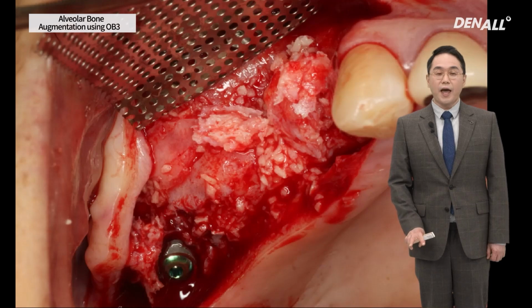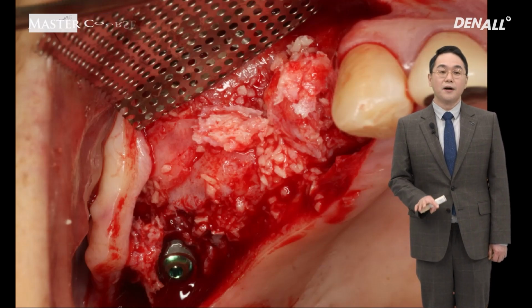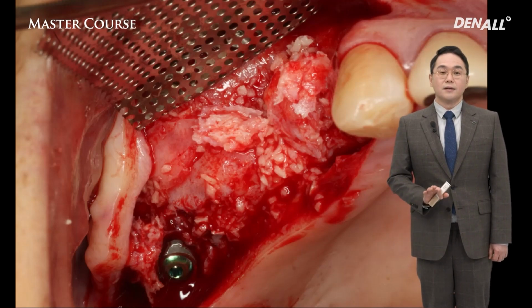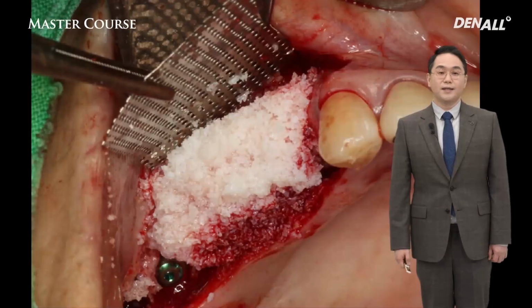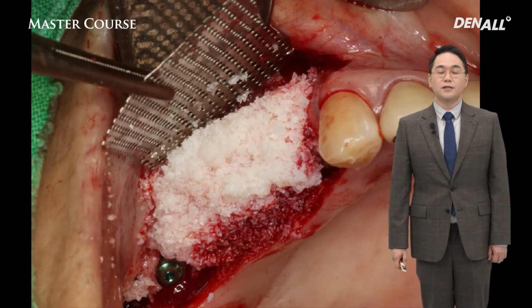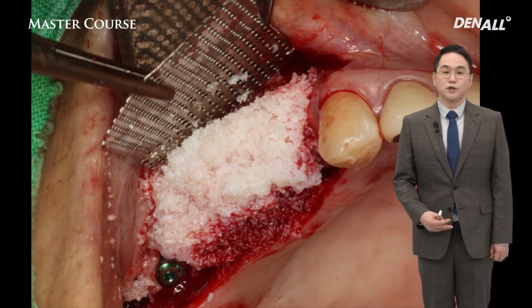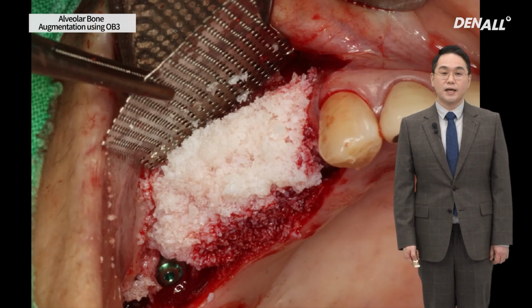Two screws are used to fix the buccal apical area. So first, stable adaptation is made apically. In the defect, the autogenous bone from the tuberosity is put in, and outside, the xenograft material, sintered at low temperature, is used to make the contour. Bone graft materials are positioned to augment vertically and horizontally for ideal alveolar bone form.